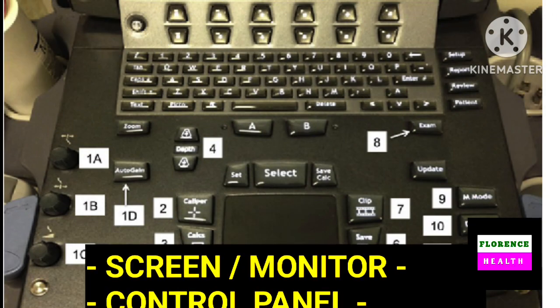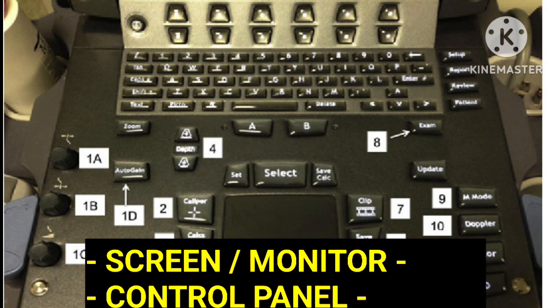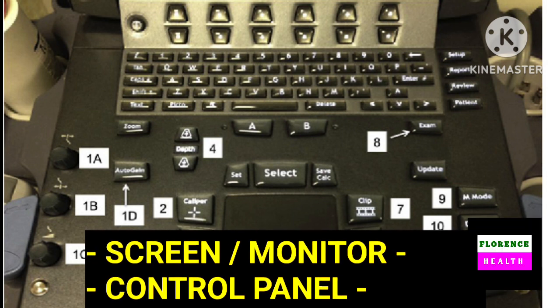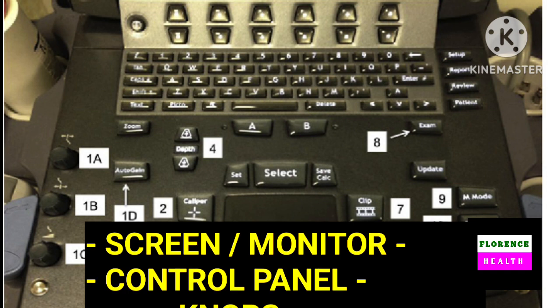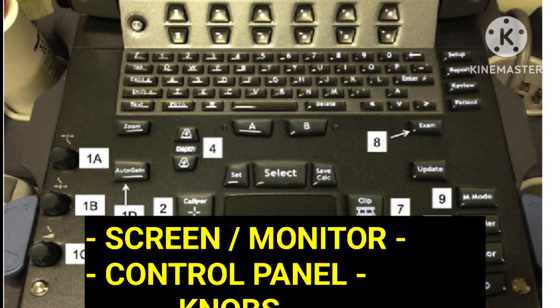As I have already told, the ultrasound machine has two parts. One is the screen or monitor, another is the control panel. The control panel has a keyboard and different types of knobs. The position of each knob is not specific. You should know where the specific knob is present in your ultrasound machine.